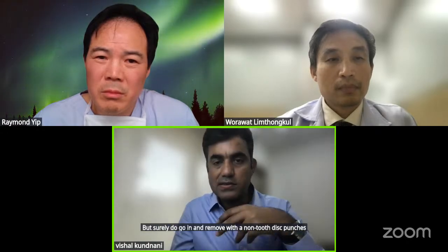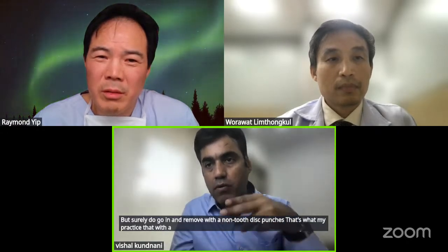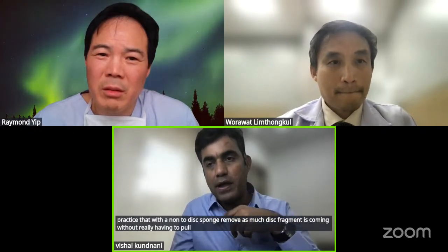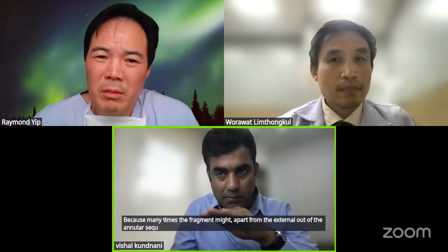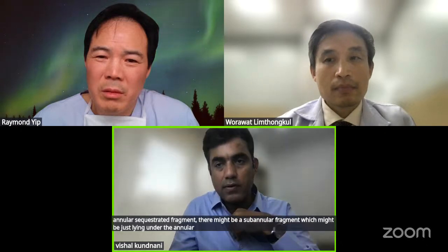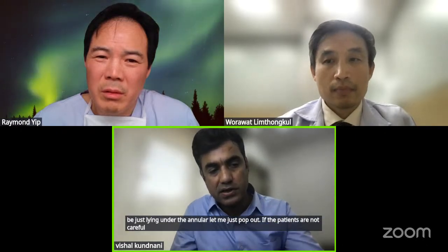That's my practice: with a non-tooth disc punch, remove as much disc fragment as comes without having to pull out or scrape out. And use a subannular nerve hook, because apart from an external sequestrated fragment, there might be a subannular fragment lying under the annulus, which may just pop out if the patients are not careful enough in the first 6 to 8 weeks.